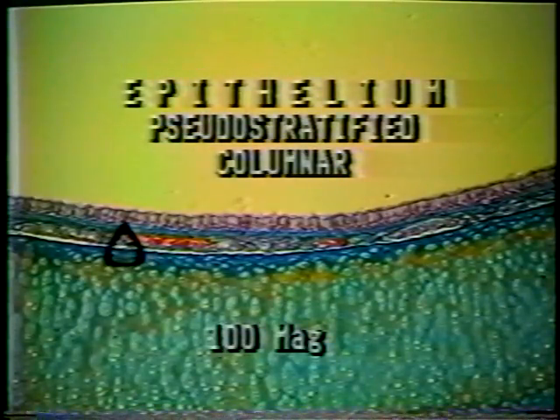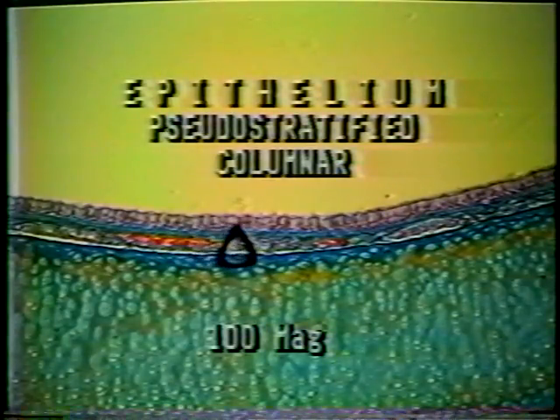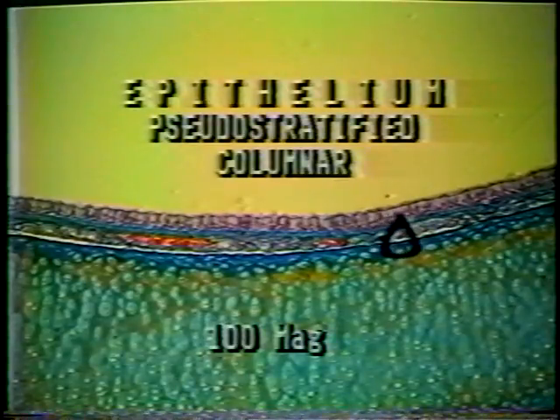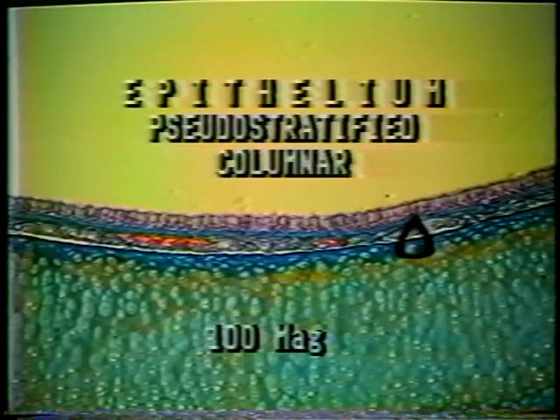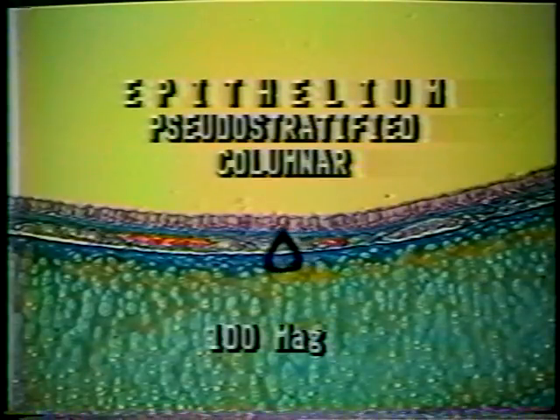Remember that epithelia are located along free margins. One border is exposed on a surface, and in the case of the trachea, the opening or lumen is the windpipe. The other border is the attached basement. Actually, most of the remaining tissue below is cartilage supporting the trachea.